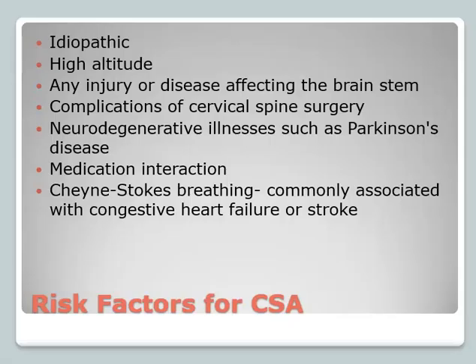Cheyne-Stokes, you guys remember from Patty's class, is that crescendo-decrescendo pattern of breathing, very commonly associated with CHF, and they found the severity of the Cheyne-Stokes breathing correlated with the severity of the patient's CHF. The more end-stage the CHF got, the worse the Cheyne-Stokes was.